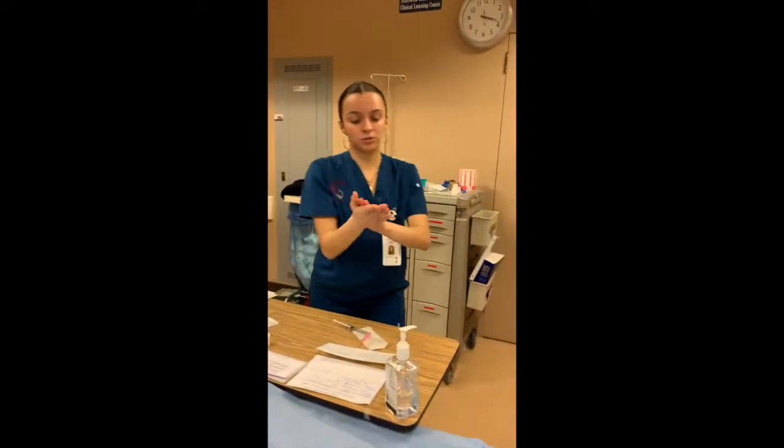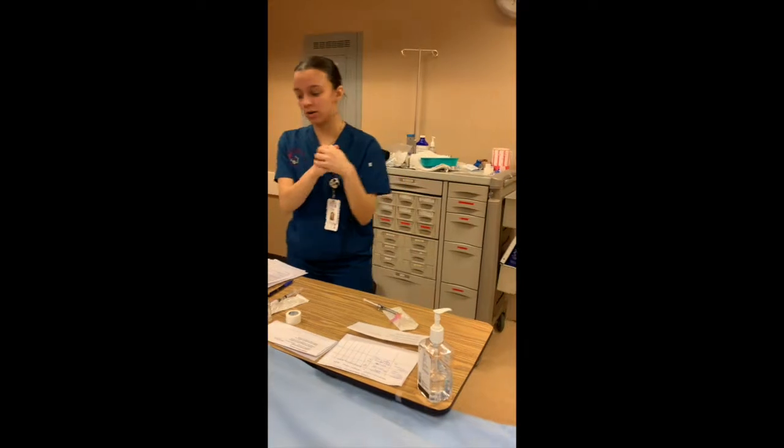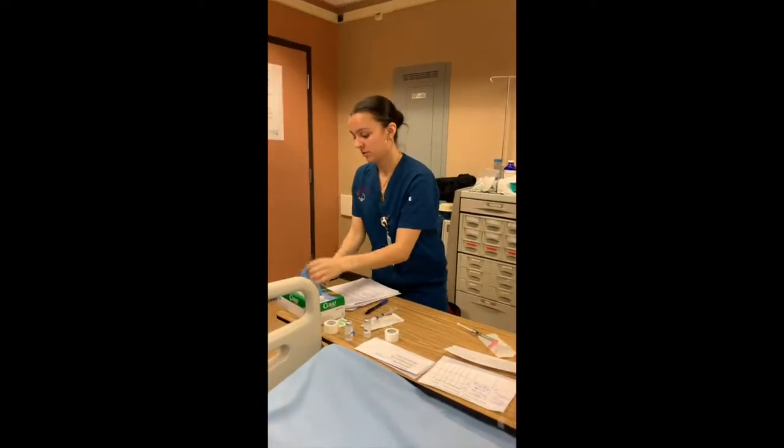So I'm just going to perform the proper hand hygiene once again, just using the alcohol rub. And after using the alcohol rub, I'm just going to be putting some gloves on. All right.